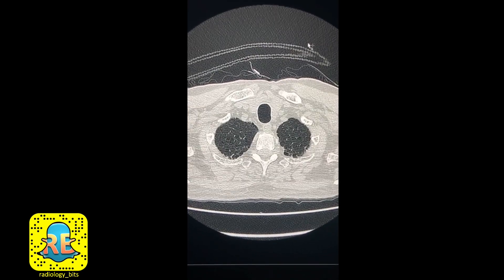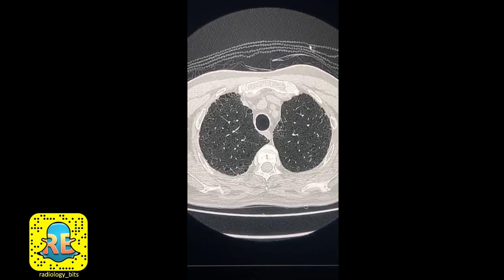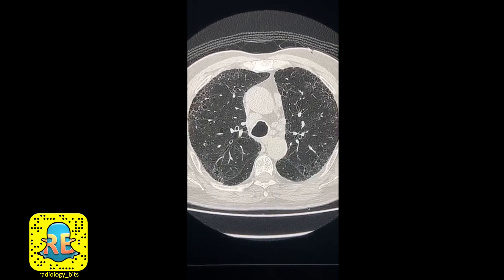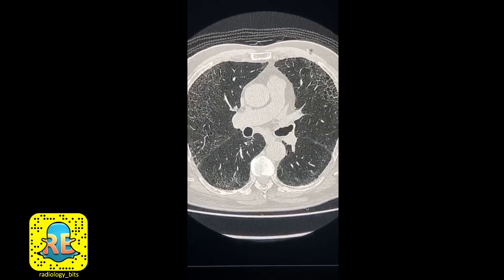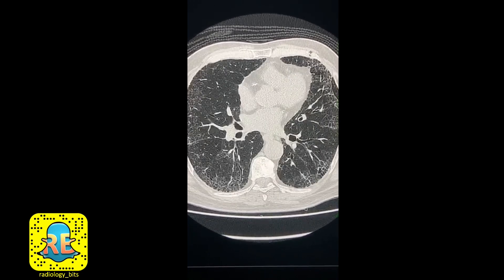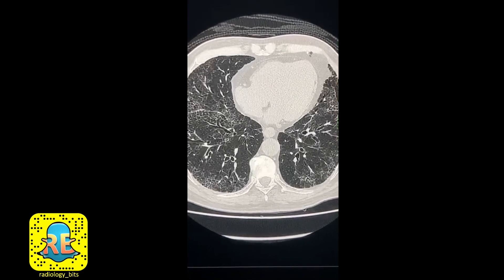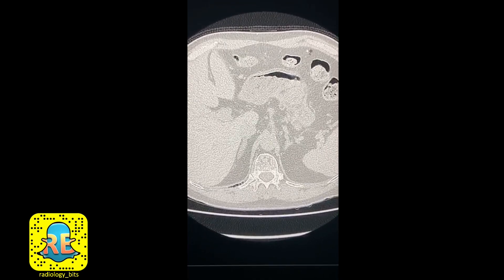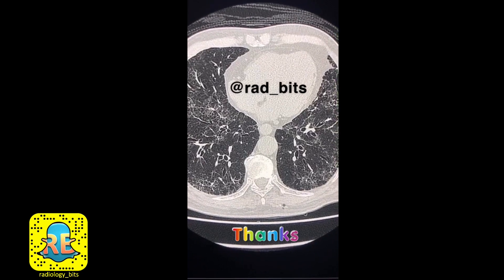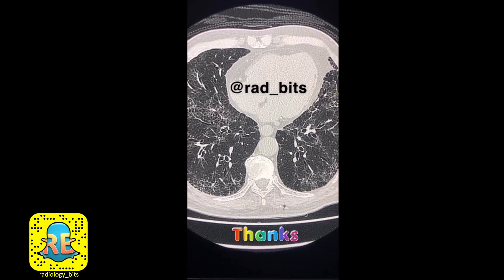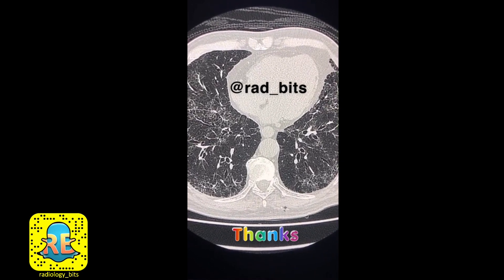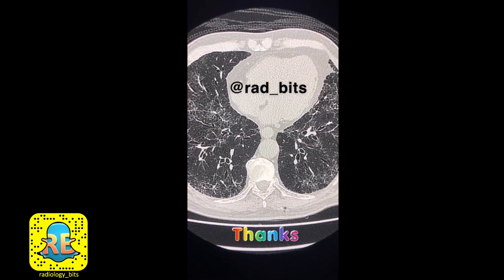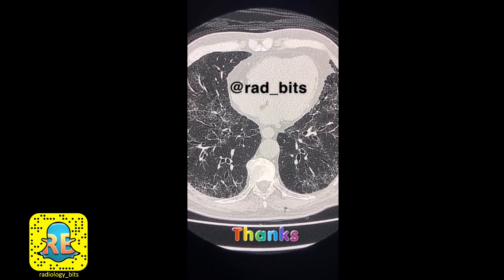Here's the challenge on the same patient — this is the lung window. A quiz is available at the RadiologyBits Twitter account. If you haven't followed that account, it would be useful to follow it since they post lots of information and cases there as well.